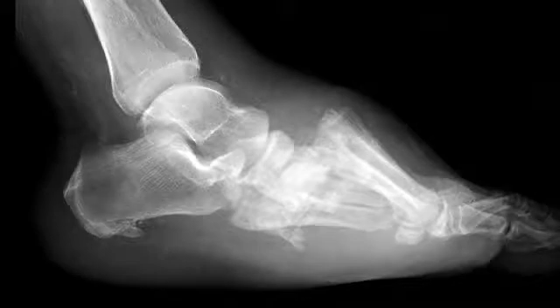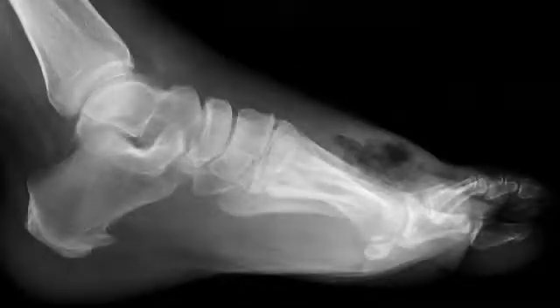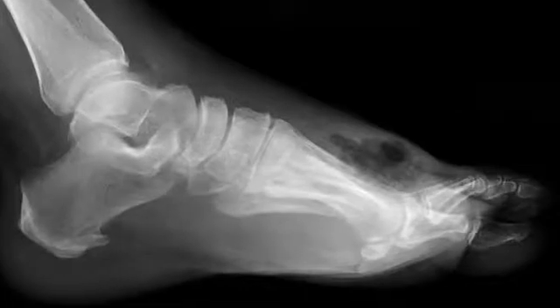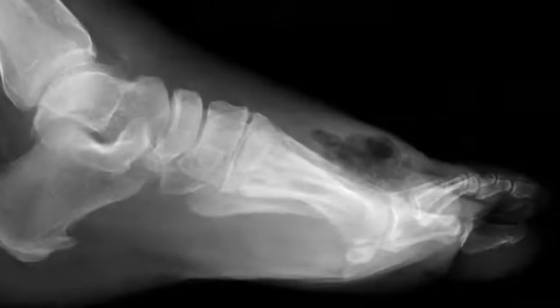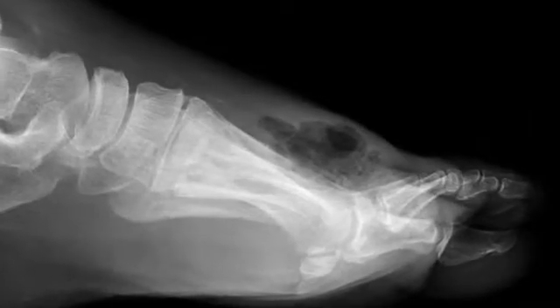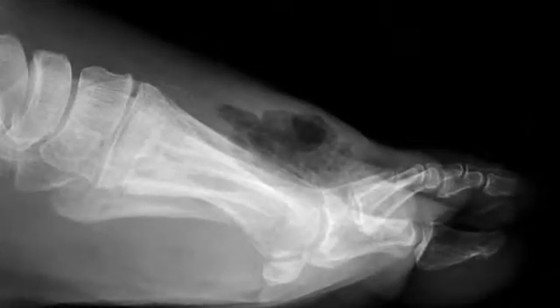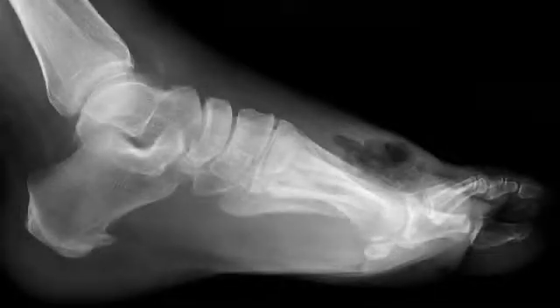the anatomical alignment. Ironically, this patient was seen 1 year ago for ulcerative gas gangrene, and you can actually see his x-ray of the same foot 1 year prior with normal anatomical alignment. There's no indication on this x-ray that he is prone to developing a Charcot or fracture dislocation. He was just walking, normal activity, when it occurred.